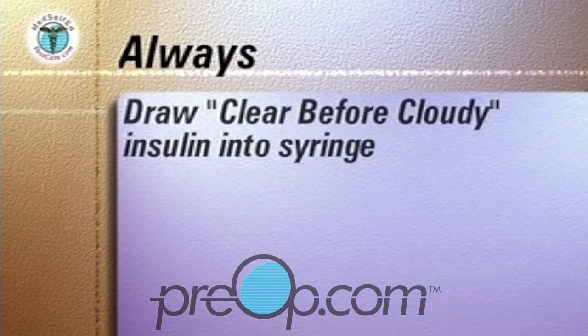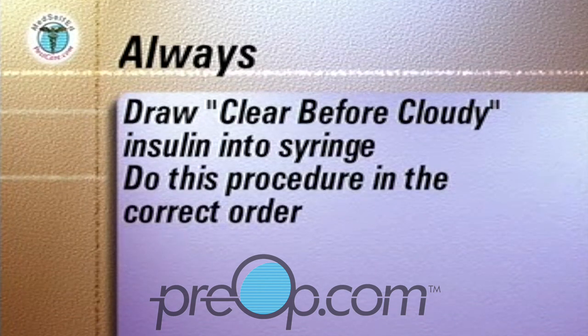Always draw clear before cloudy insulin into the syringe. This is to prevent cloudy insulin from entering the clear insulin bottle. Always do this procedure in the correct order as shown in the following sequence.